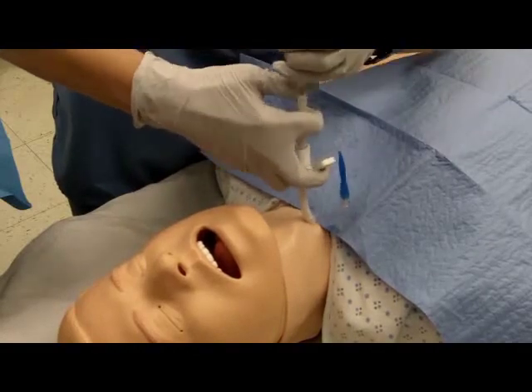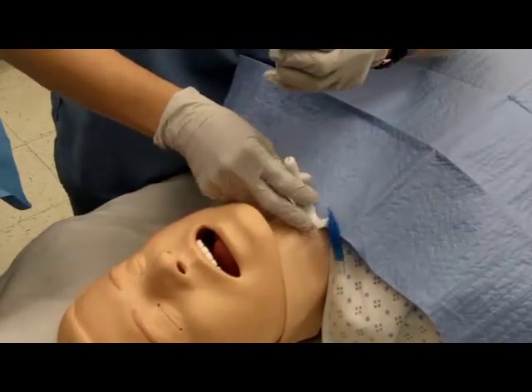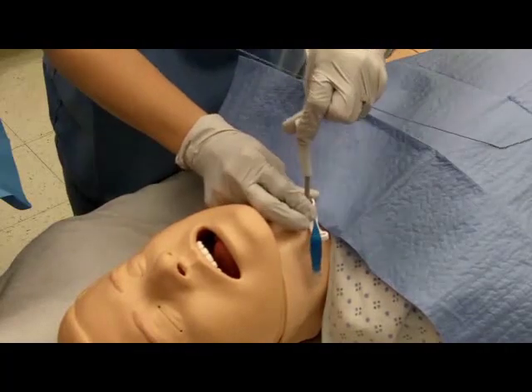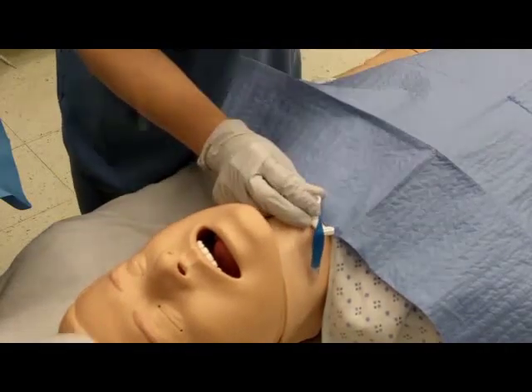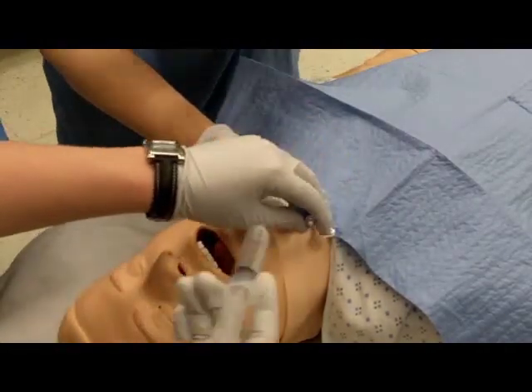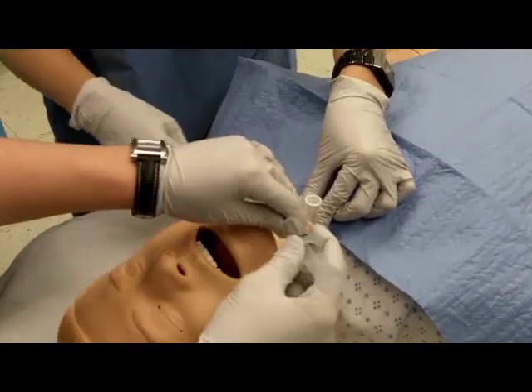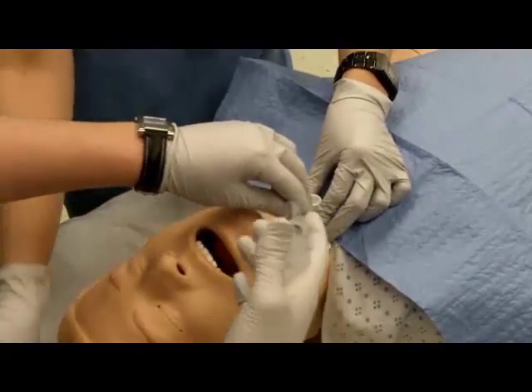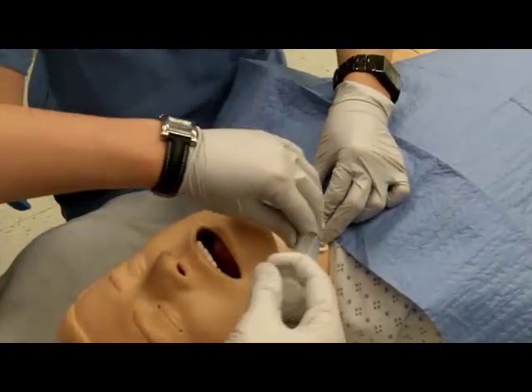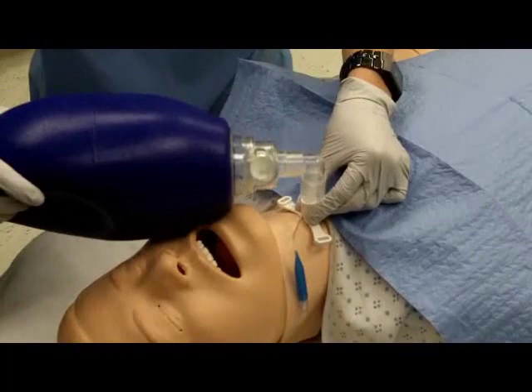Once the tracheostomy tube is fully inserted, remove the dilator and guide wire, leaving the tracheostomy tube in place. Inflate the cuff and secure the airway with ties or sutures.